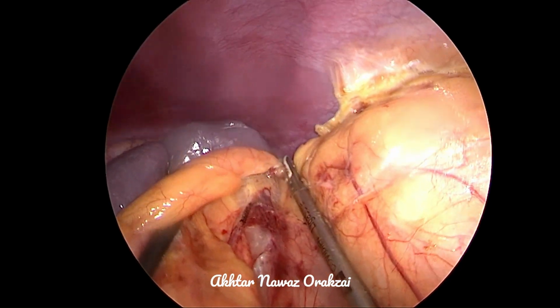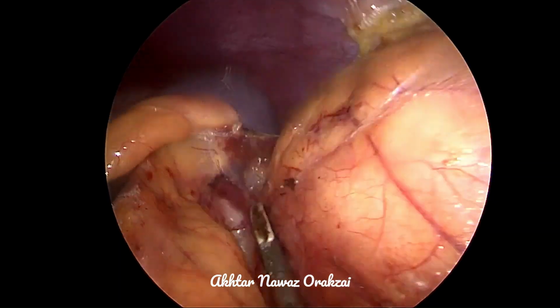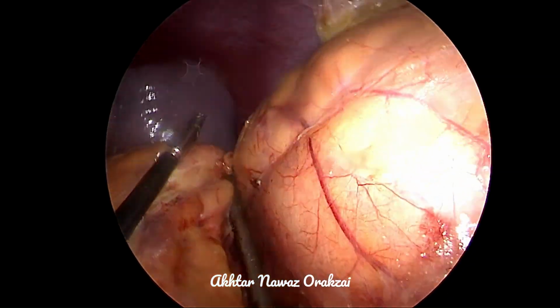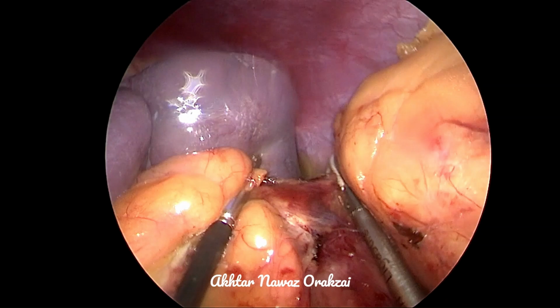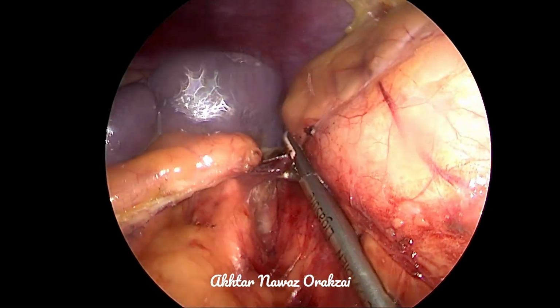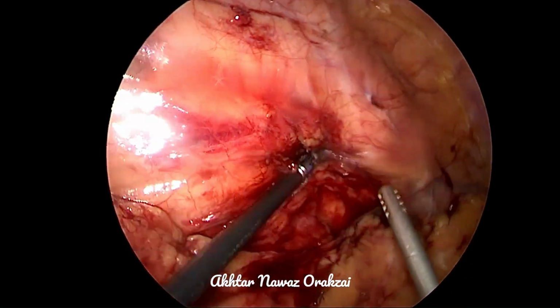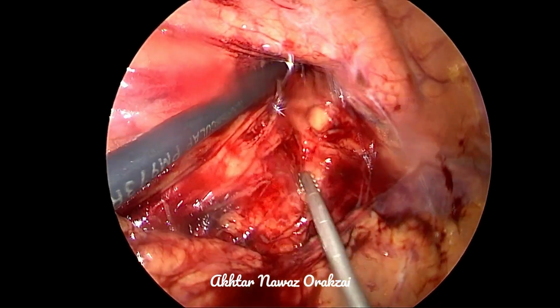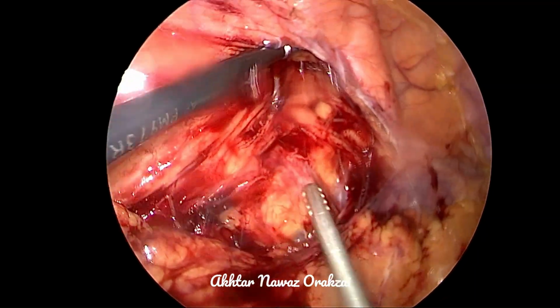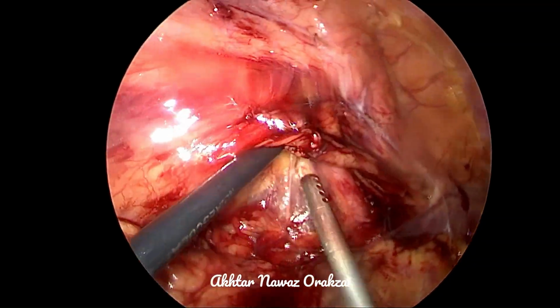You can see the adrenal gland, the edge of the adrenal gland, and shortly afterwards the tail of the pancreas will also be visible. Care must be taken while dissecting the uppermost portion of the peritoneum, because one can injure the greater curvature of the stomach, which is popping out behind the spleen.